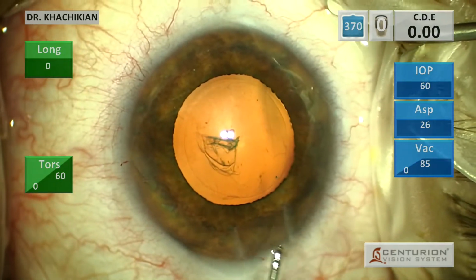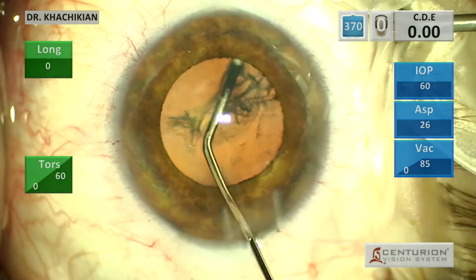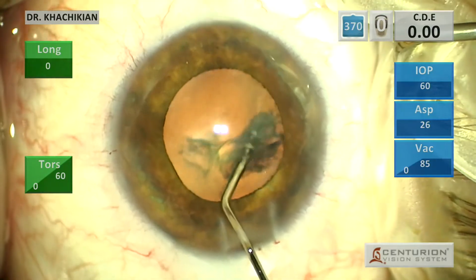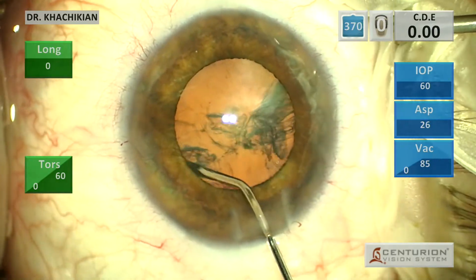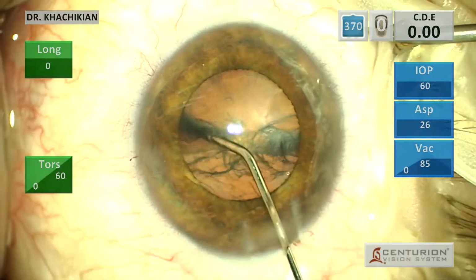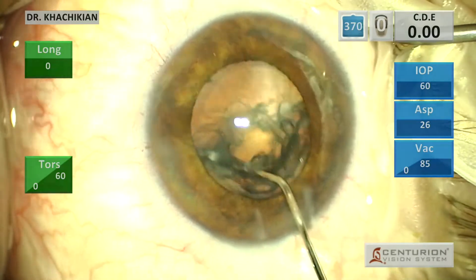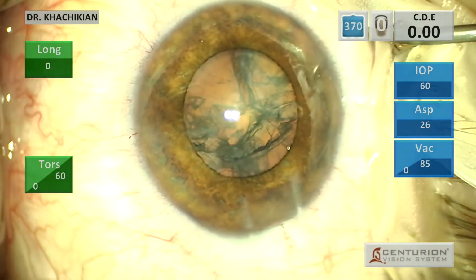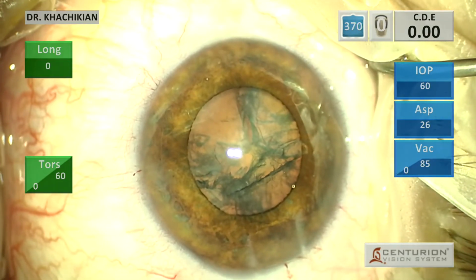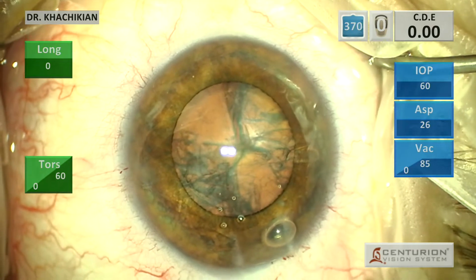We then will do some hydrodissection and hydrodelineation with BSS. I use just a 27 gauge cannula because I feel that seems to work the best in my hands. I never really got the hang of the Chang cannula. Once the lens rotates, you've got your hydrodissection, and then I usually will bury the 27 gauge cannula and do some hydrodelineation and spin the lens at the same time to ensure that we get good 360-degree hydrodelineation.